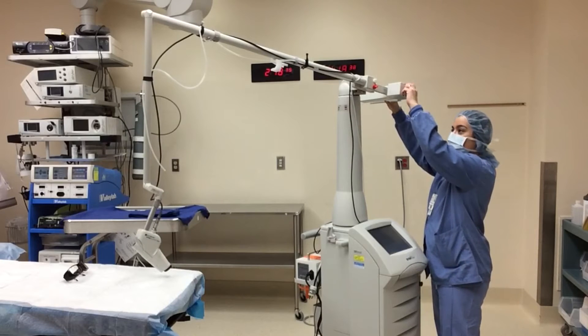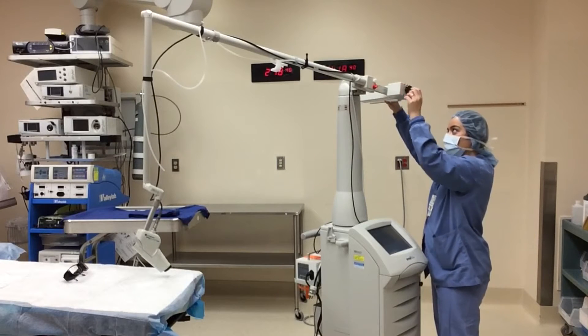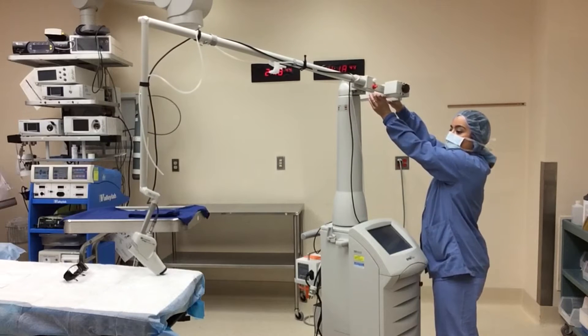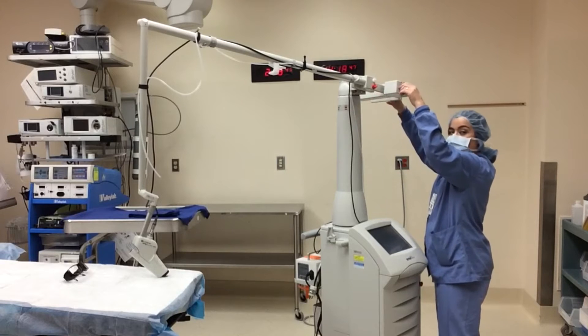Once the handpiece is connected, the laser arm can be balanced. Loosen the knob and move the weight until the arm is balanced. You will know you are in the correct position when the arm is steady and at a 90 degree angle.